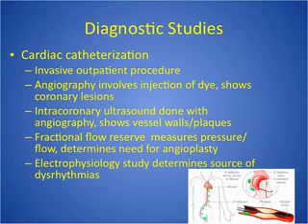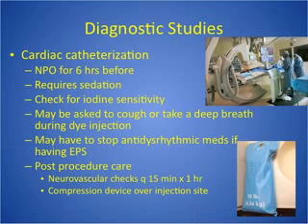Pretty common, but they're there watching and ready to give medications. They could, though, cause an MI or a stroke if they put that catheter up and dislodged a plaque while they were there. And then also very unlikely but possible is to puncture one of the ventricles of the heart or to puncture the lung. Both of those would be very, very bad, of course. So it's really important that you understand nursing care with a cardiac cath, because we do get a lot of these patients back and monitor them afterwards.